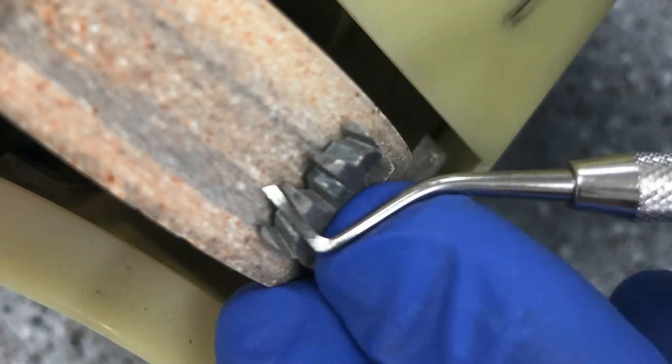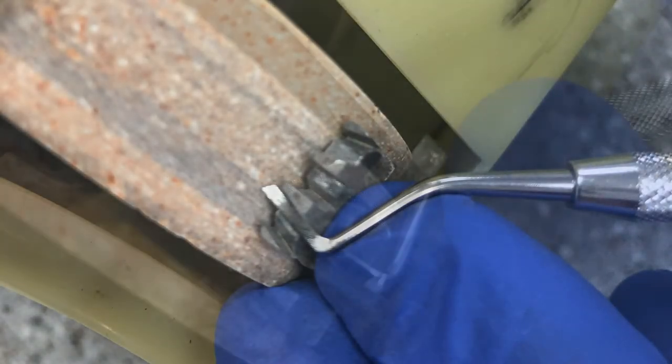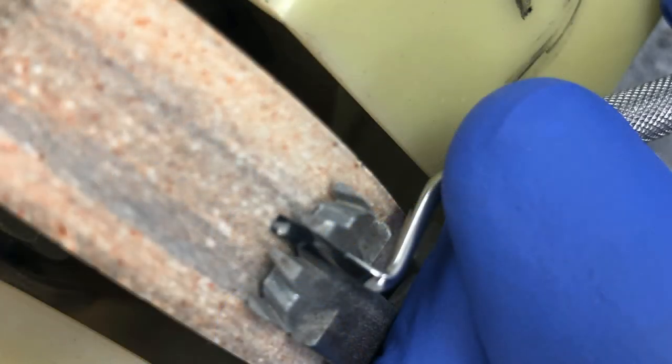Before turning the machine on and sharpening your instrument, it's always a good idea to try positioning your instrument in the guide to make sure you have the blade oriented correctly against the wheel.